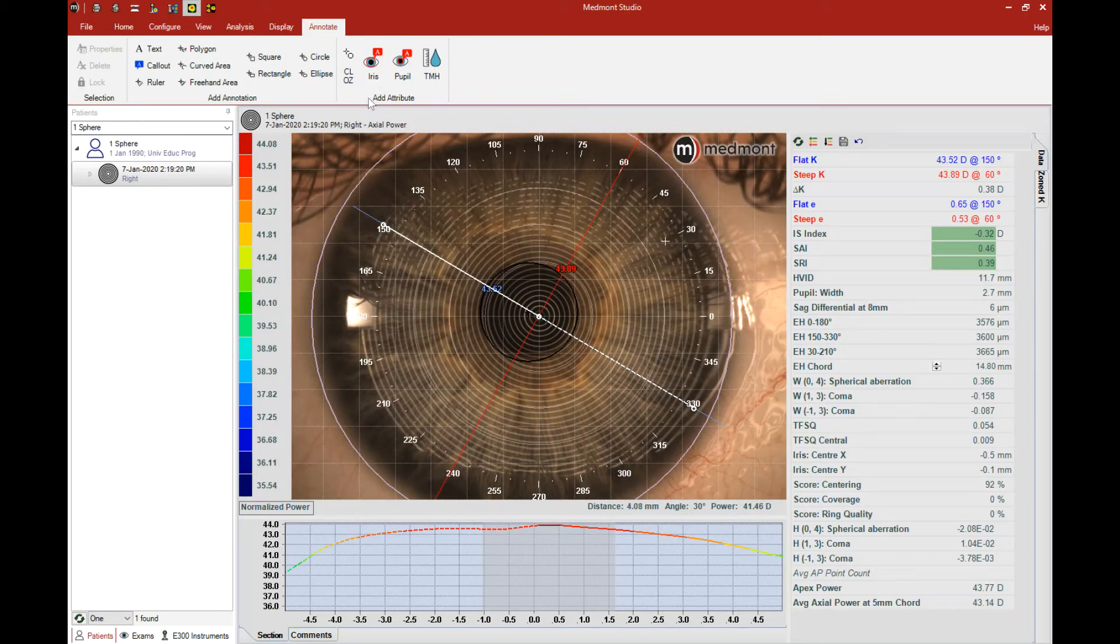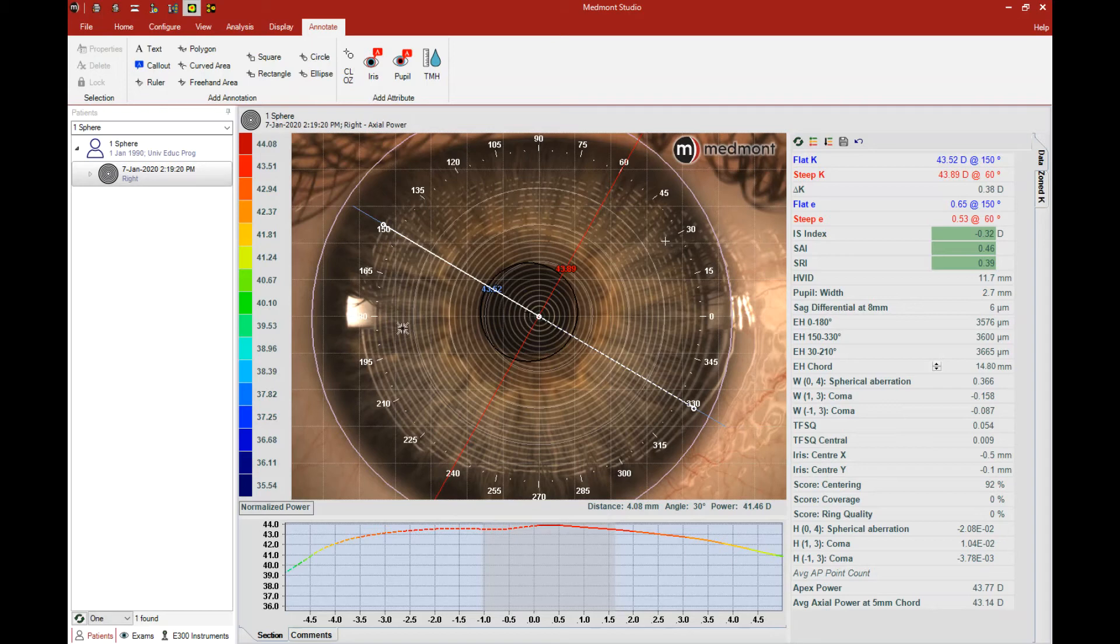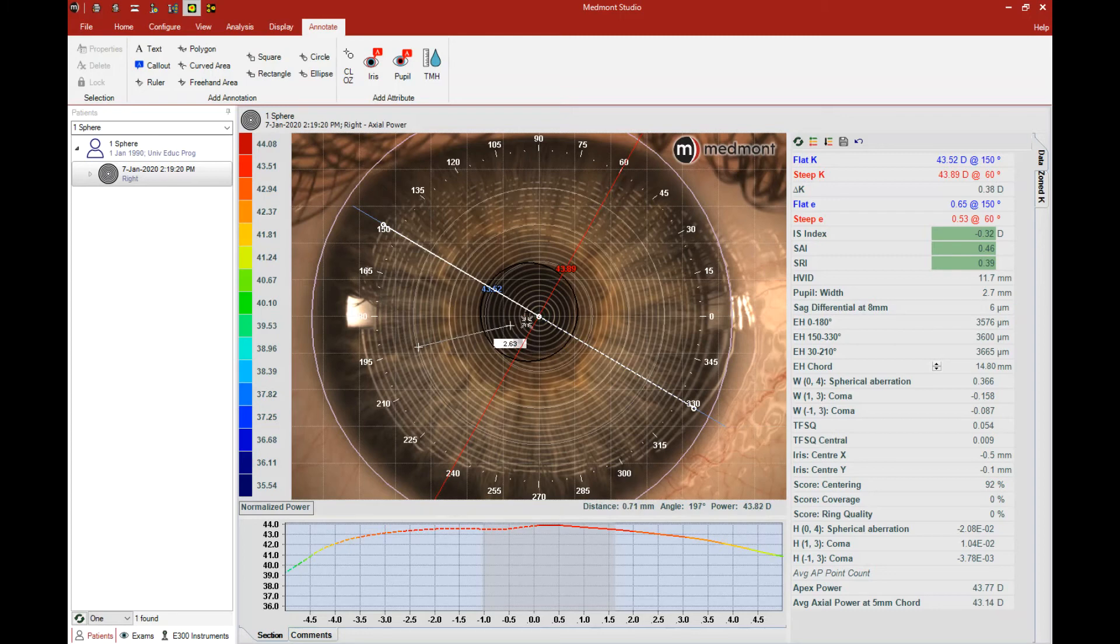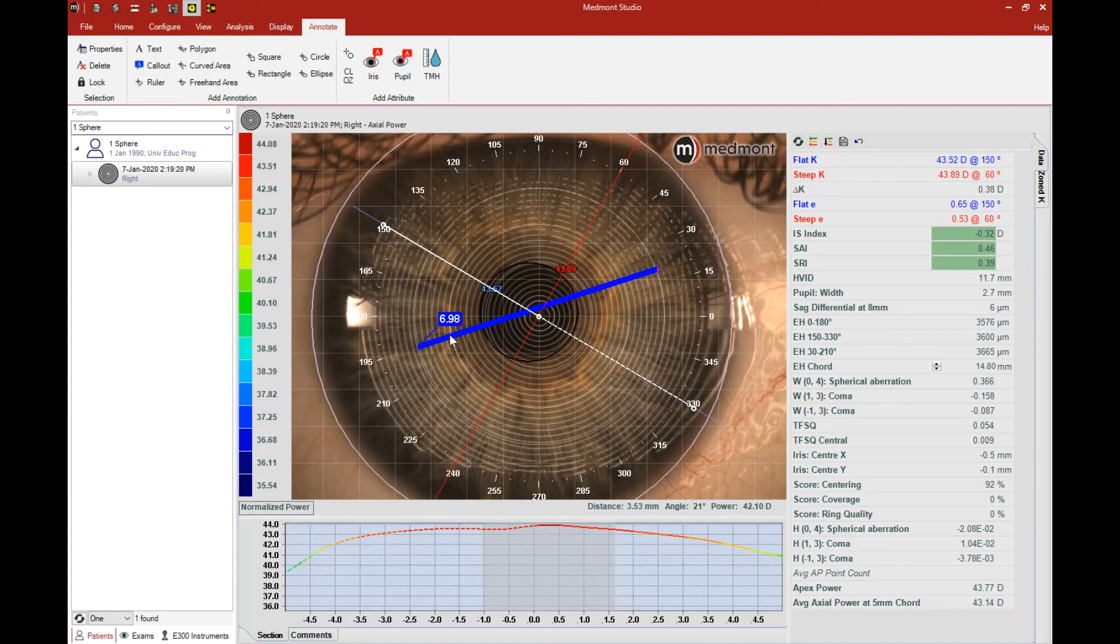Another measurement tool you can select from the annotation window is the ruler. If you're measuring the size of the cone in a keratoconic patient or the optics across the distance zone of the lens, you can click the cursor on one point and drag it to another point. It will determine that length to the 100th of a millimeter.